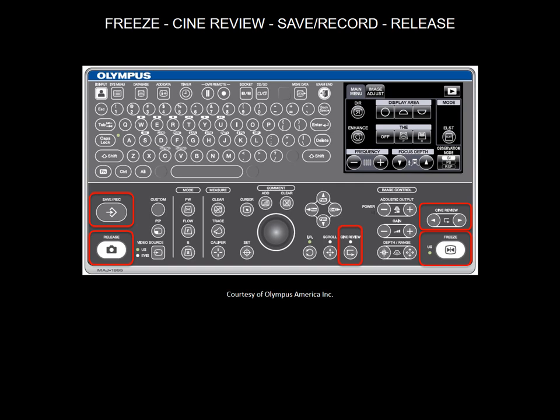After freezing, you can use the Cine review button or the trackball to review images. It allows the user to go back frame by frame, and press release to print ultrasound images.